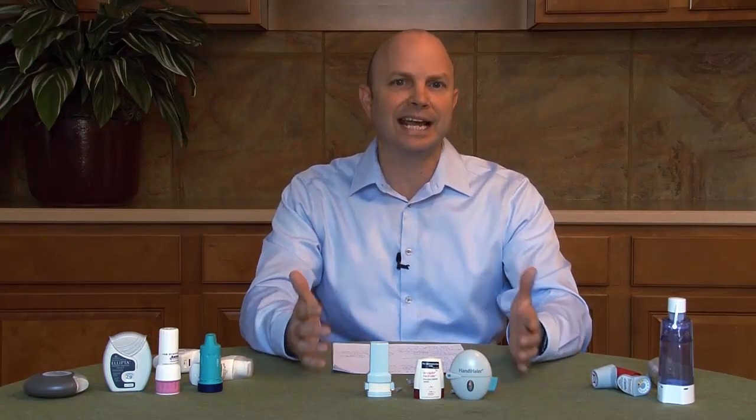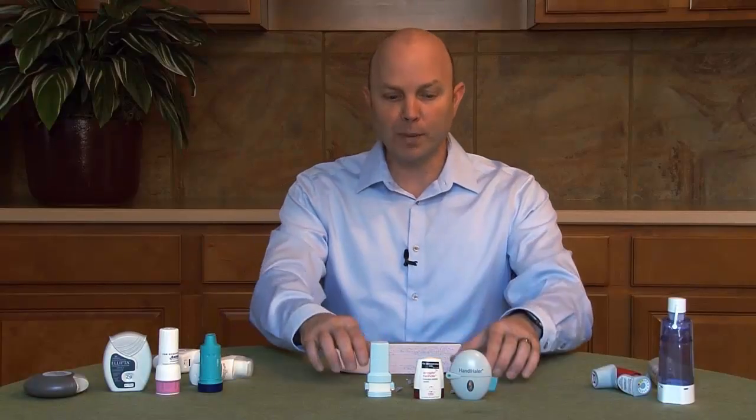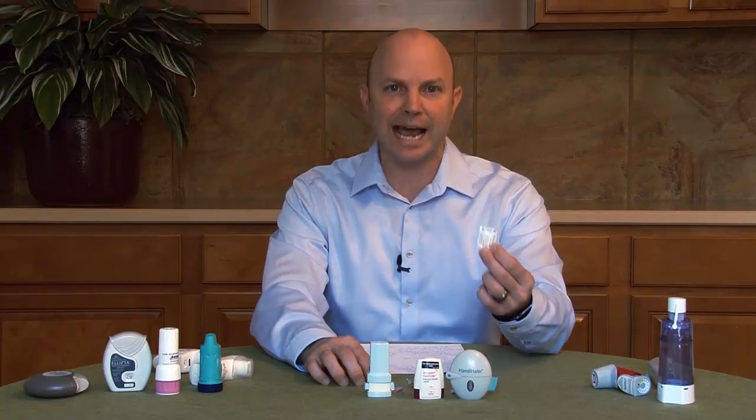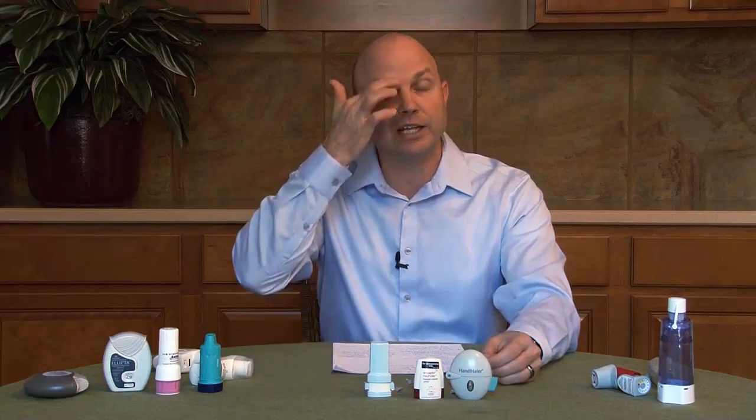There's a couple general rules that I think you should follow that'll make it very easy for you to remember and to take these medicines. General rule number 1, it's a good idea to always wash your hands before you take the medicines and then again at the end of taking the medicines. The one where it matters most is when you use these capsules, where touching the medicine might cause a skin irritation or an irritation of the eye that will cause your pupils to become dilated. But again, it's just a good idea and less to remember if you just wash your hands before and after taking all your medicines.